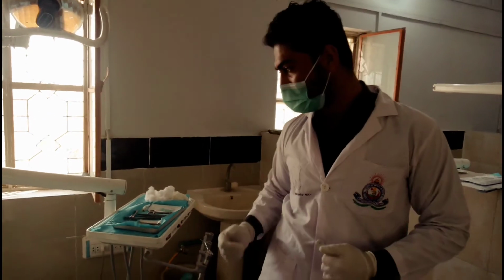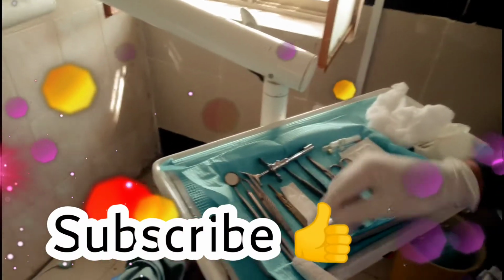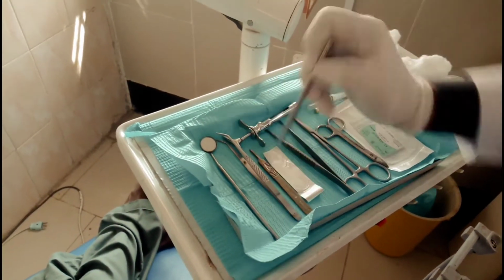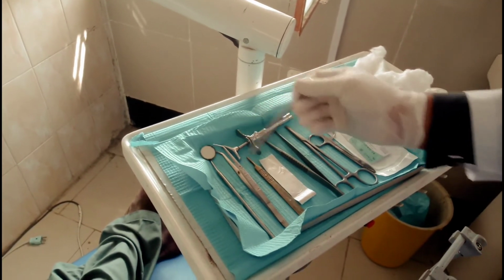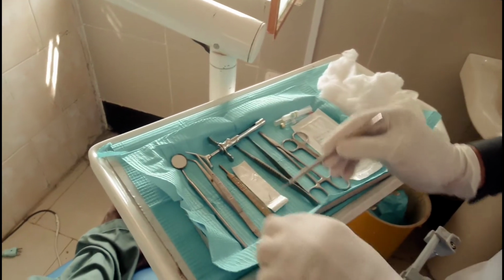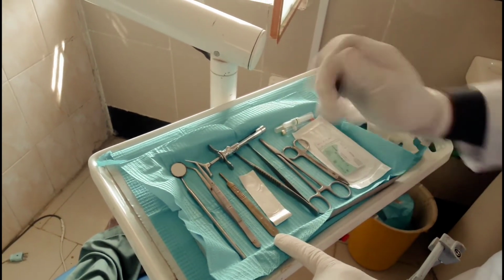So now I will show the instruments. First of all, we have these instruments. These are examination instruments. This is the dental mirror and this is the tweezer. These are the basic examination instruments. This is the scalpel handle number 3, which is mostly used in the oral cavity. This is the blade number 15.